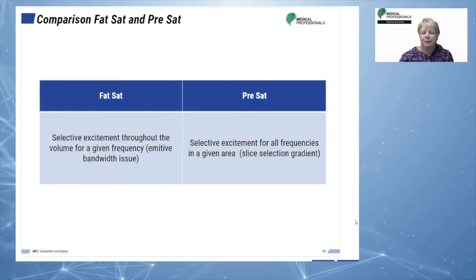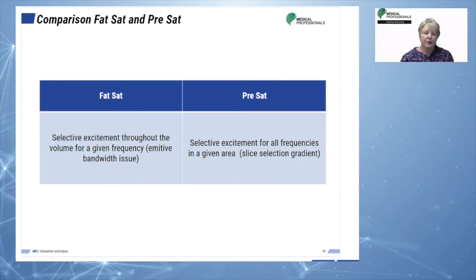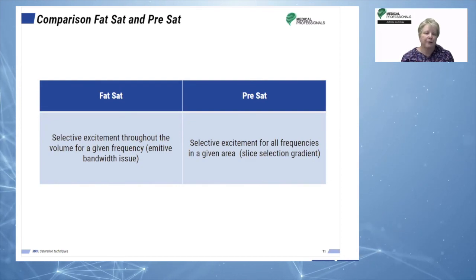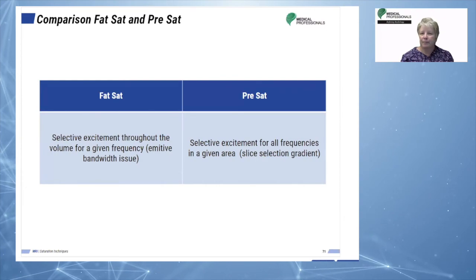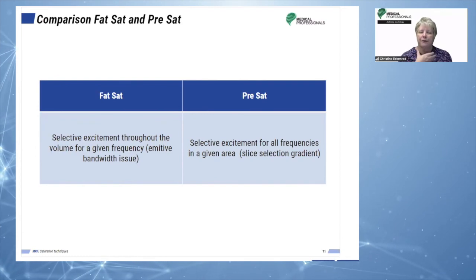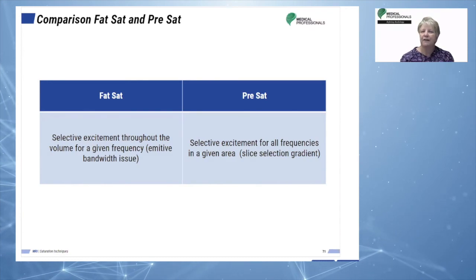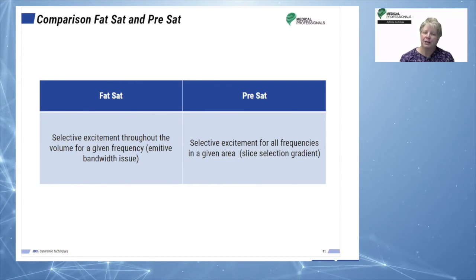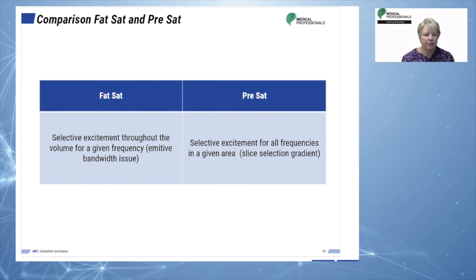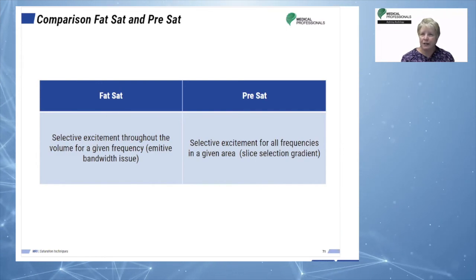We also can use pre-saturation pulses when we're talking about breathing motion. For instance, when we're doing a cervical spine and the patient is not going to be able to hold their breath for a 3 or 4 minute acquisition, we put a band in front of the cervical spine over the trachea and over the esophagus. So when the patient swallows and when the patient is breathing, that's not affecting our image quality. Those are just different uses for those types of saturations.